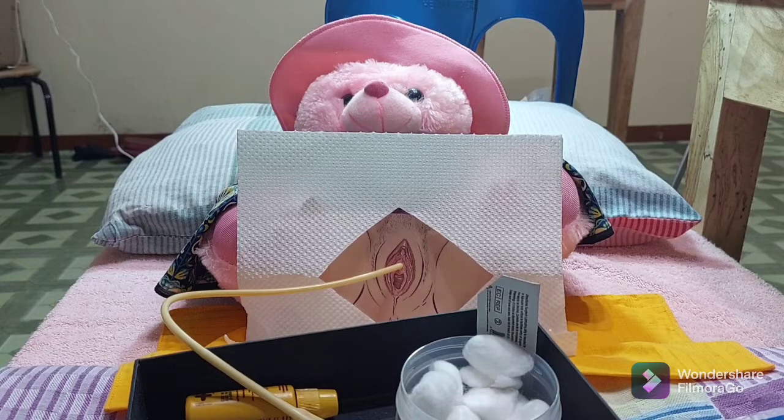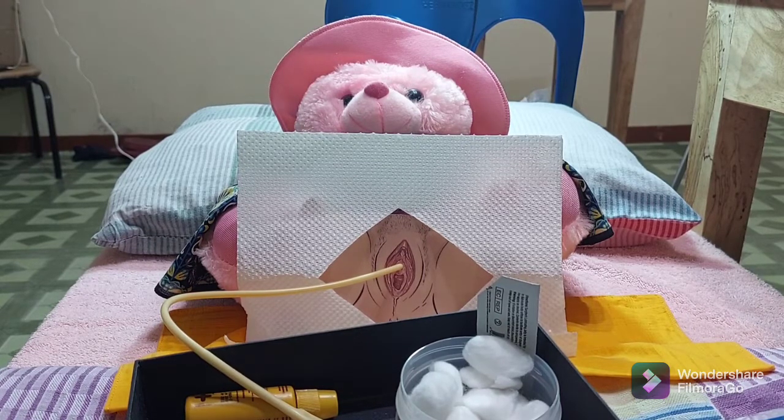Note, if urine does not appear in a female patient, the catheter may be in the patient's vagina. You may leave the catheter in the vagina as a landmark and insert another sterile catheter. Note, if the catheter does not advance in a male patient, do not use force. Ask the patient to take deep breaths and try again. If the catheter still does not advance, stop the procedure and inform the physician. The patient may have an enlarged prostate or urethral obstruction.